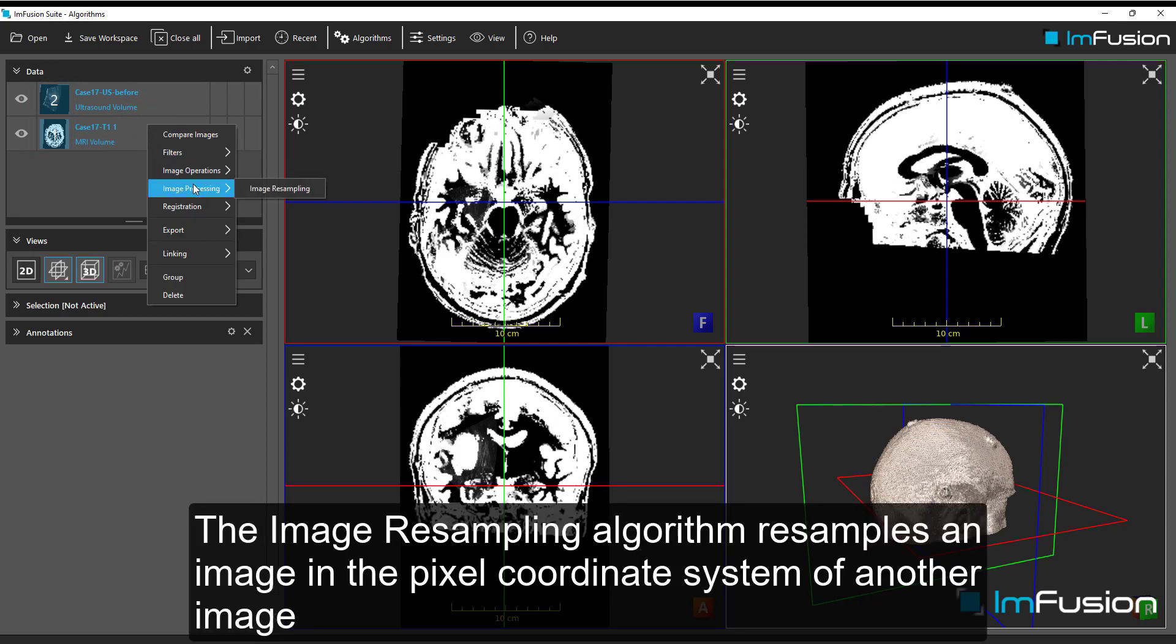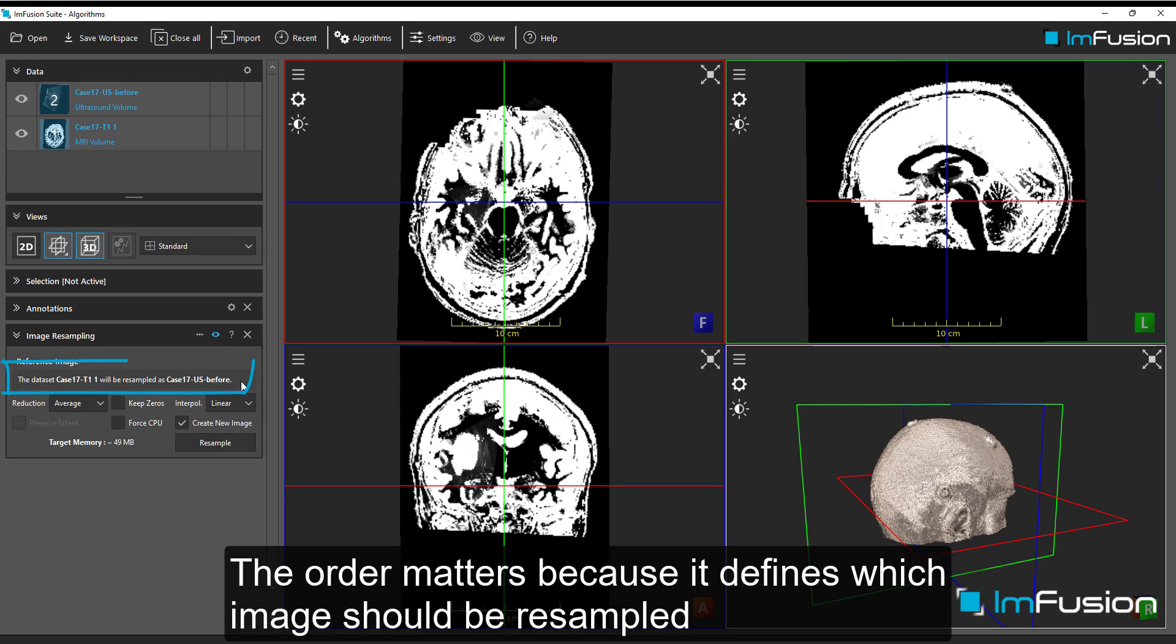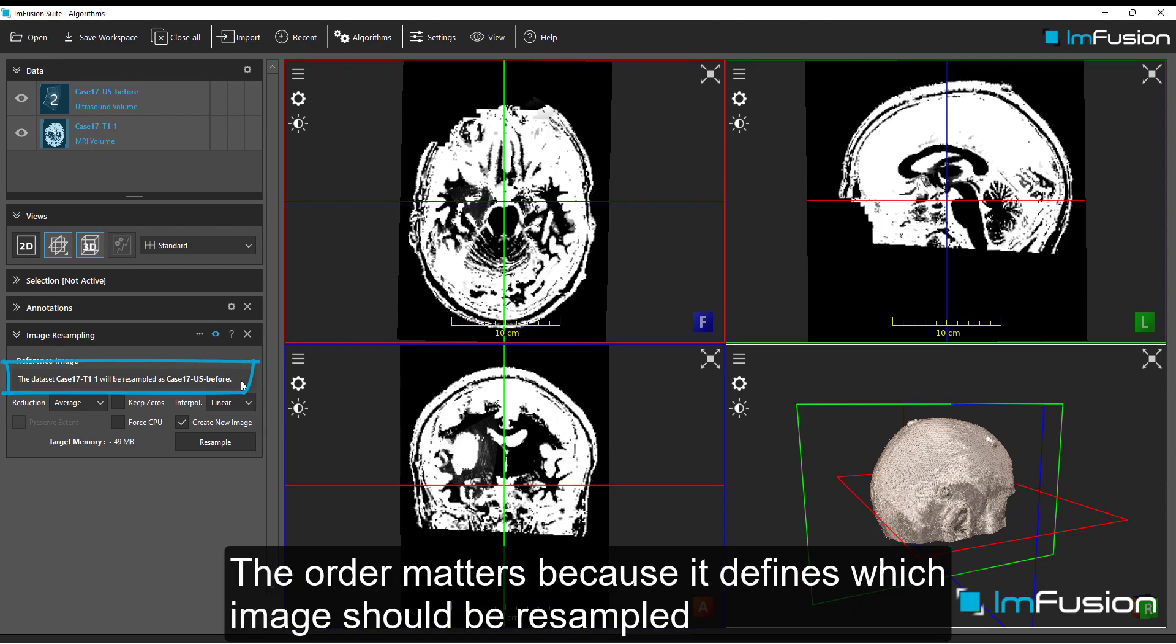The image resampling algorithm resamples an image in the pixel coordinate system of another image. The order matters because it defines which image should be resampled.